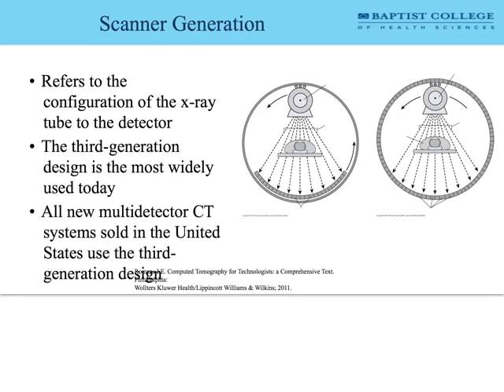This third generation allows for a certain amount of scatter acceptance beyond which it's not going to accept image-forming X-ray. So again, this aperture operates like a grid. It's going to filter out scatter. That's awesome, right? Because it will increase our image resolution that much better. It's one of those kind of hidden awesomenesses of third generation scanning.